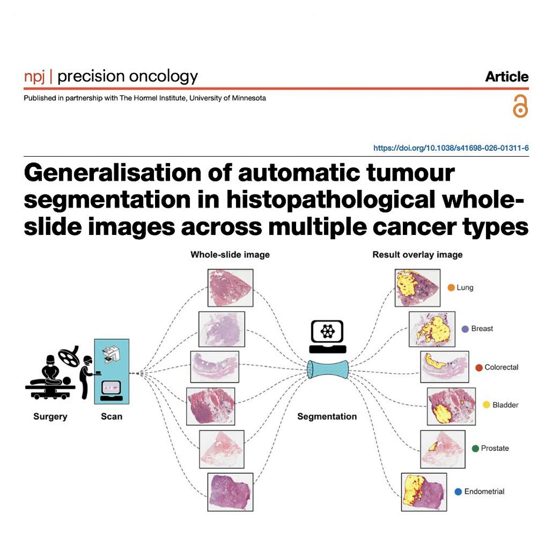Yes. But this new specialized pan-cancer model blew MedSam out of the water on this task, right? It did, largely because a fine-tuned, specialized architecture with 7.3 million parameters dedicated solely to the microscopic chaos of tissue will naturally outperform a generalist model, even when that general model is given a bounding box hint. Makes total sense. But honestly, the most revealing part of the entire study was the pathologist showdown.